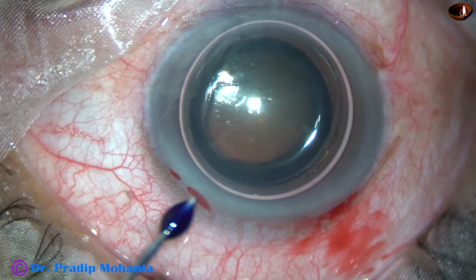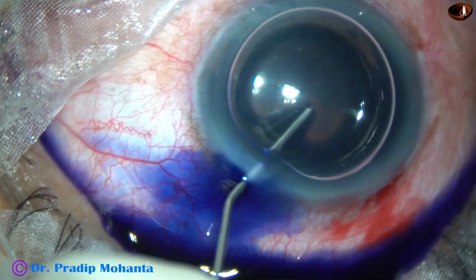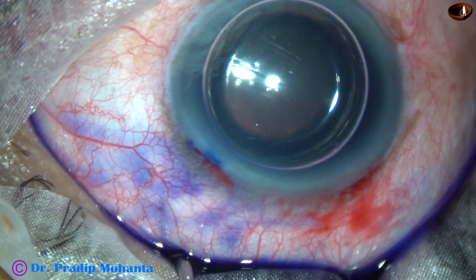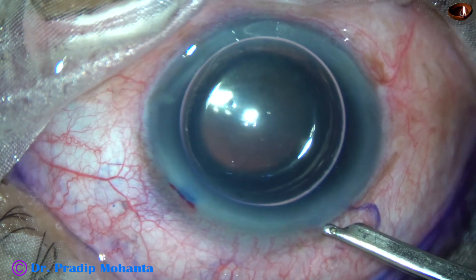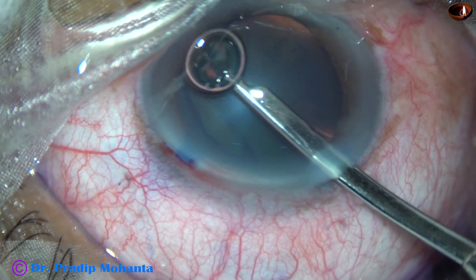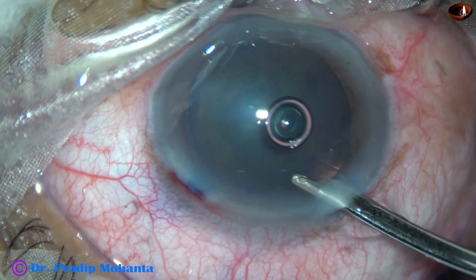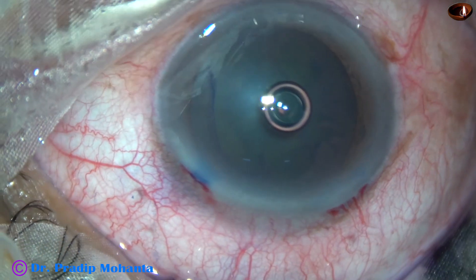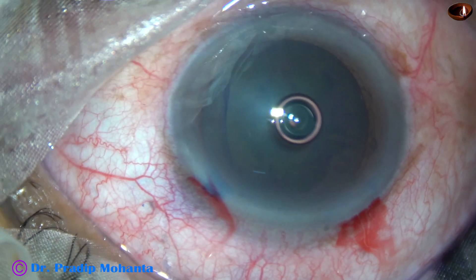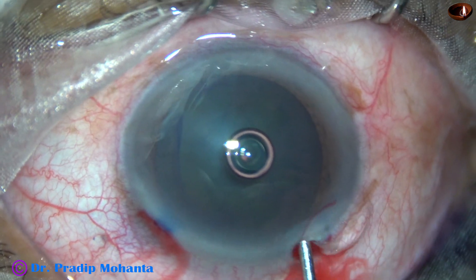This kind of wound heals nicely — faster than clear corneal wounds. The anterior capsule is now being stained with trypan blue dye underneath an air bubble. Whenever we use an air bubble, the staining is quick; we don't have to wait a minute or so. This is real time — just after applying the dye, after a few seconds, I removed the dye and there is quite nice staining of the anterior capsule.